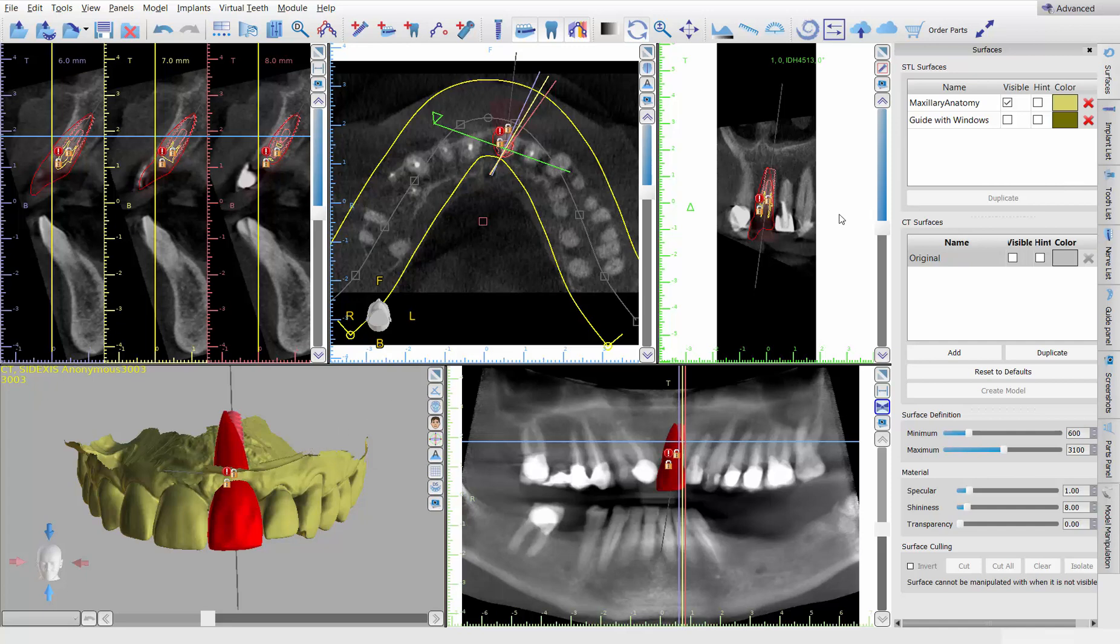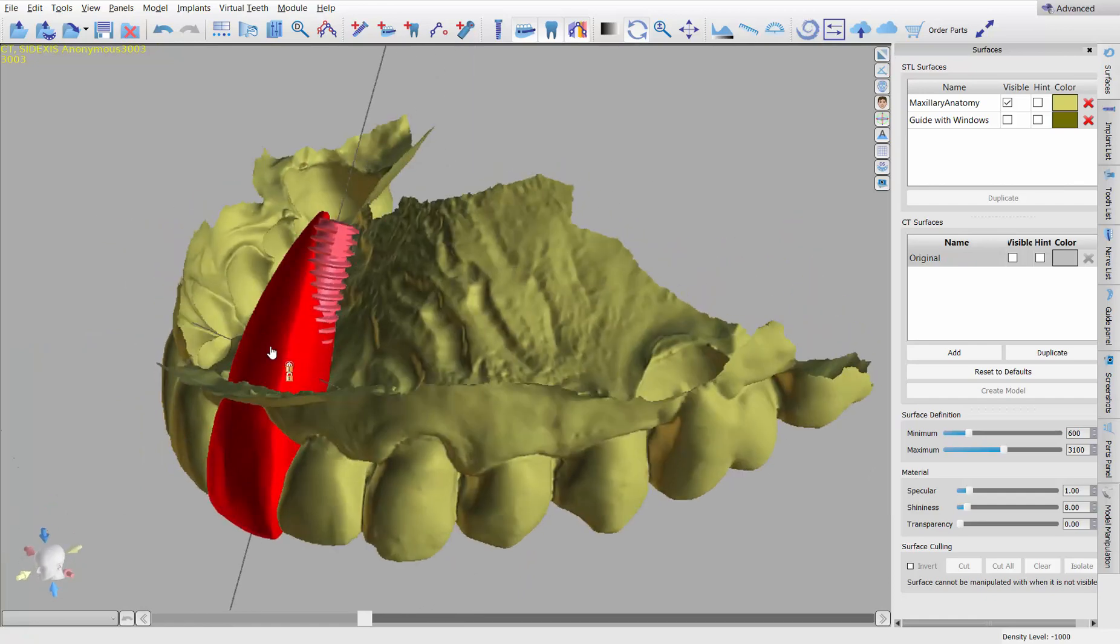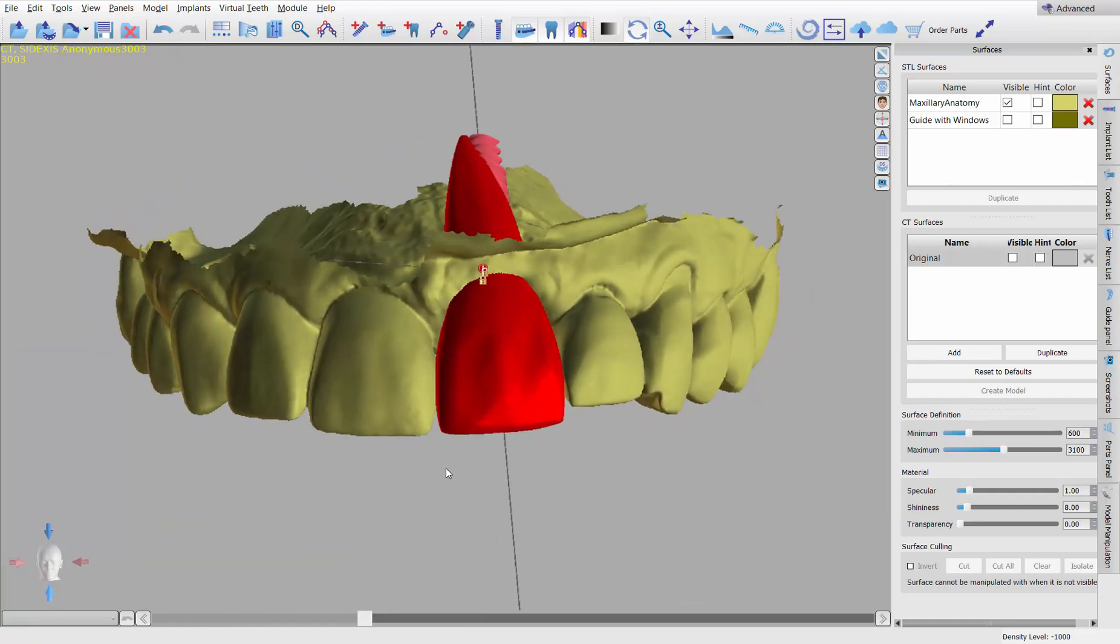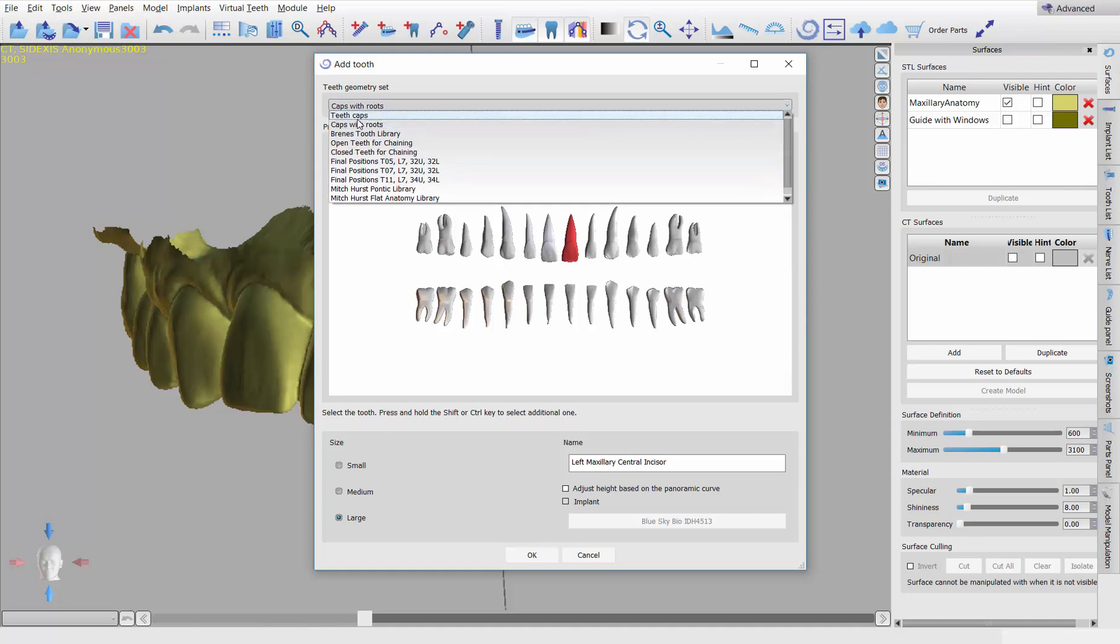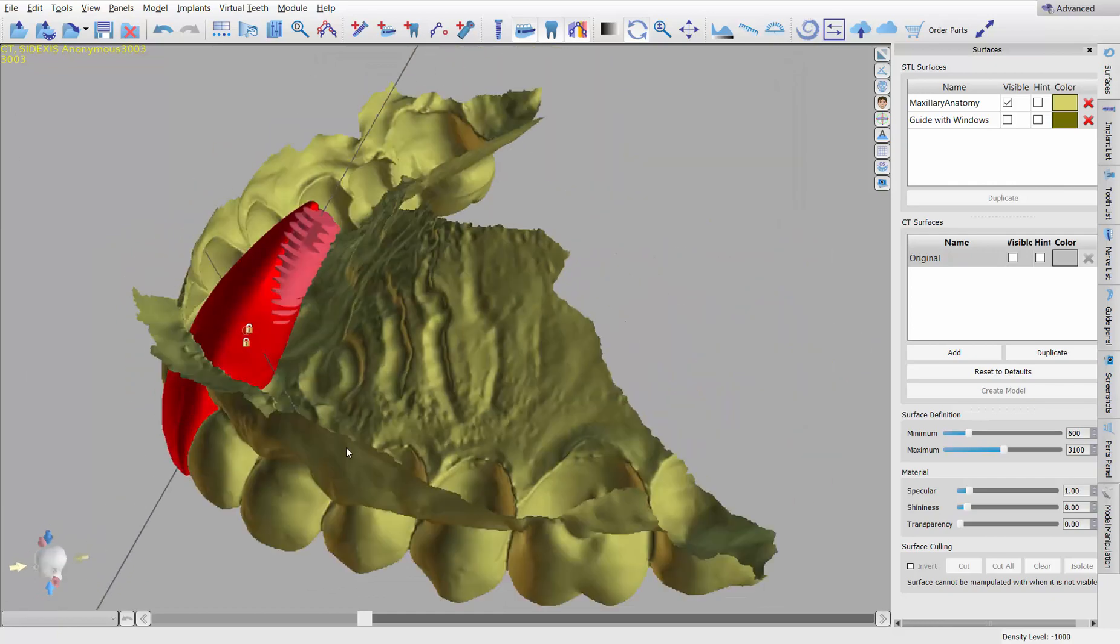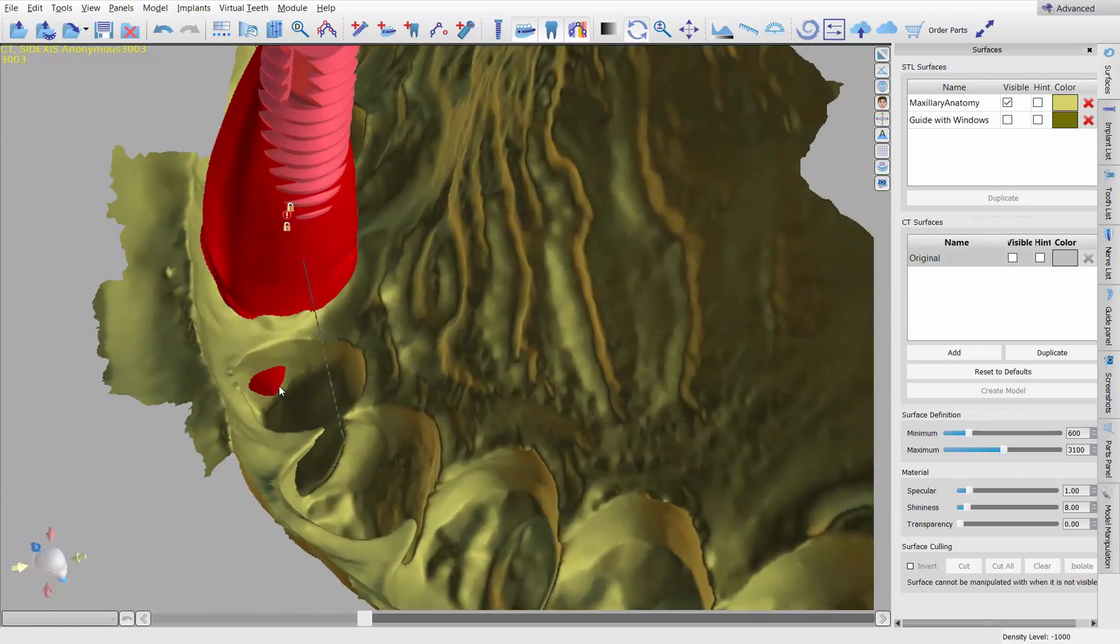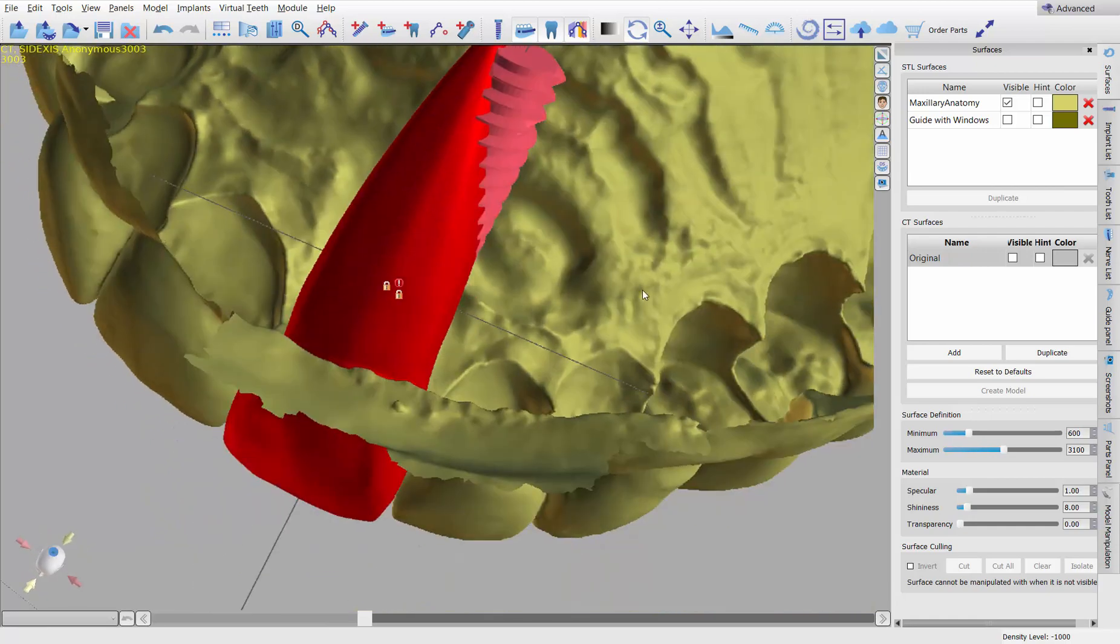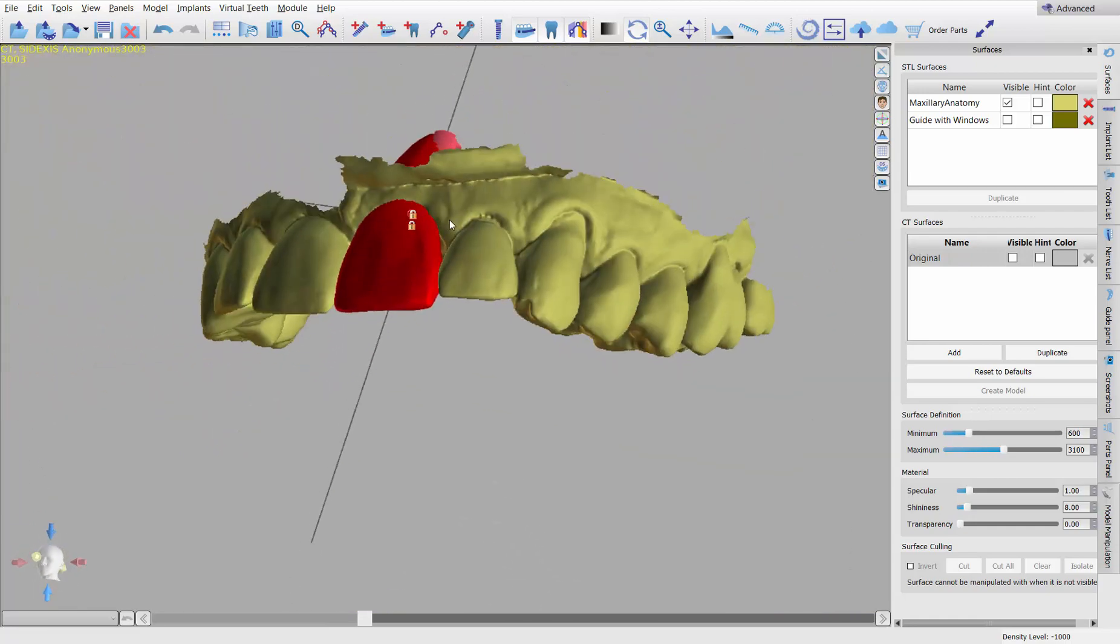So first of all, if you take a look, I've already got, obviously, like I said, the implant in place. I've got a tooth, a virtual tooth that's sort of a wax up. I did the add tooth here. And then I just made sure that instead of picking just teeth caps, I picked one with the roots. I've already gone through and scaled it to size. I'm not going to go, we've got plenty of videos out there on how to do that. Just notice that there's positive contact on both proximal surfaces. We want that.